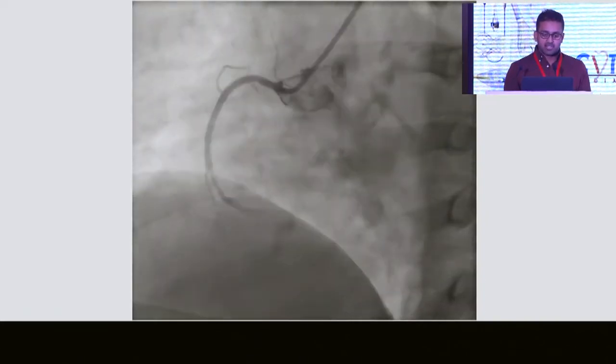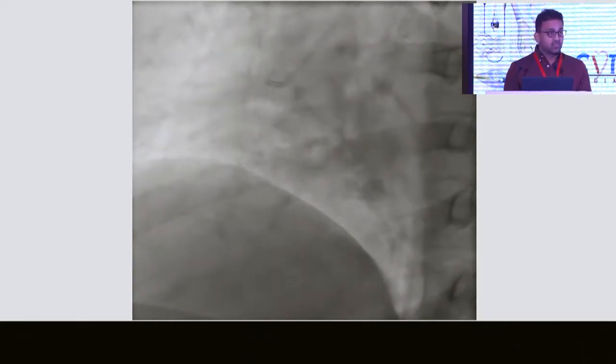And once it was lased, just took a shot, and I knew I'd have made some room. And here, a 2.5 balloon goes in, and after that, it's a piece of cake. Straightforward angioplasty. Take the guideliner all the way in, just to protect your stent as it goes in, and then you put a stent. And I don't want to go through the entire procedure. And the procedure was completed.